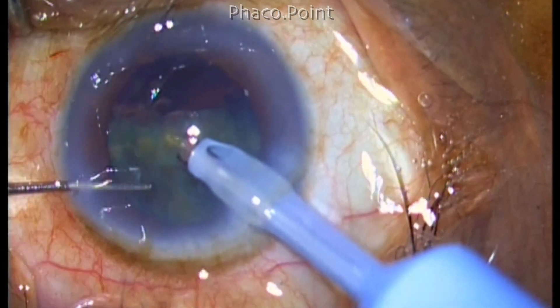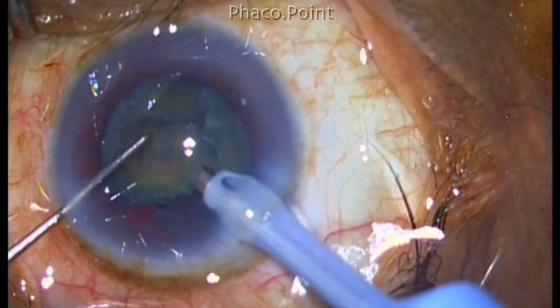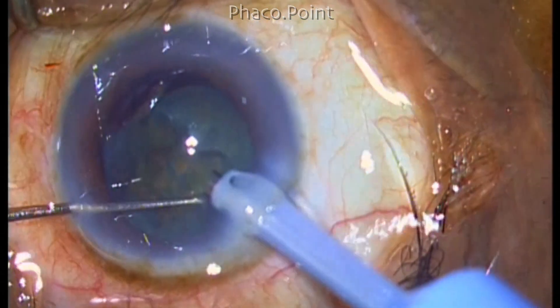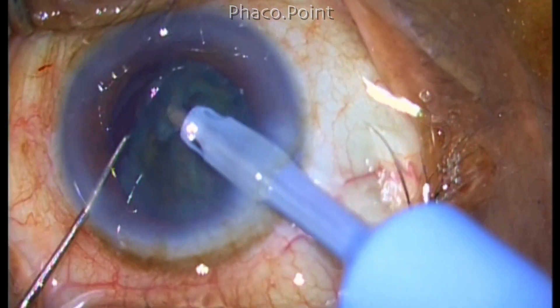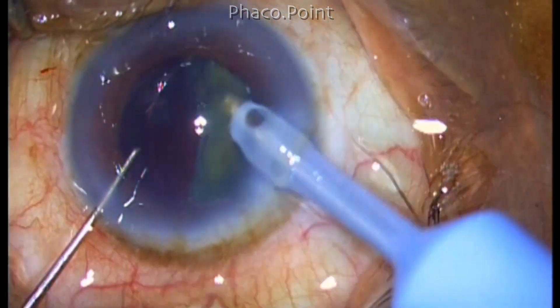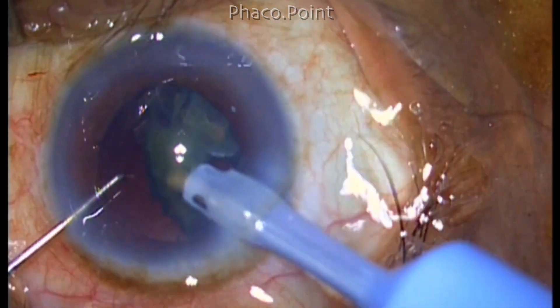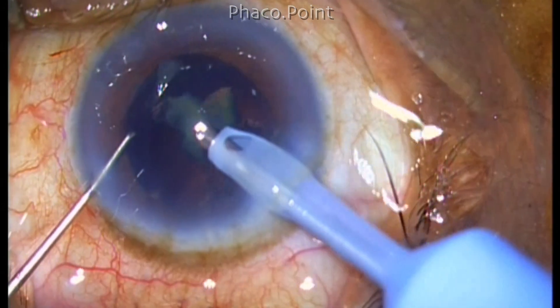Now at this point, I noticed that there is a small epinucleus fragment lying at a much deeper plane than the rest of the nucleus. This sent up alarm signals in my mind and I'm wondering whether I have already created a posterior capsular rent, because this piece looked very deep. However, the mobility of the nucleus fragment was good and therefore I proceeded with the phacoemulsification. If there was vitreous in the anterior chamber, it would definitely impede the mobility.